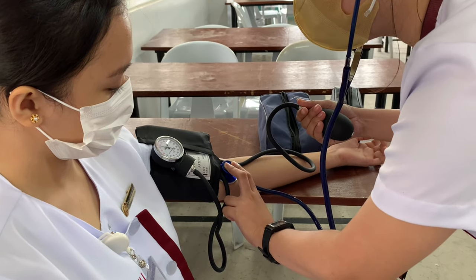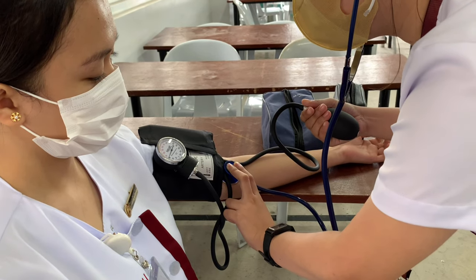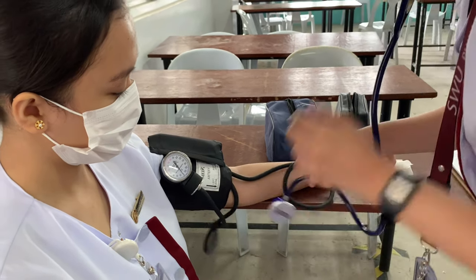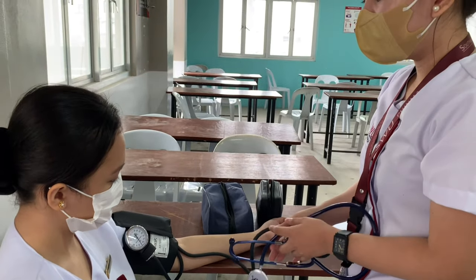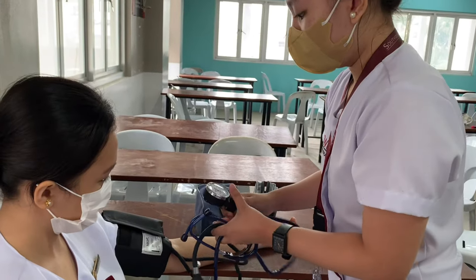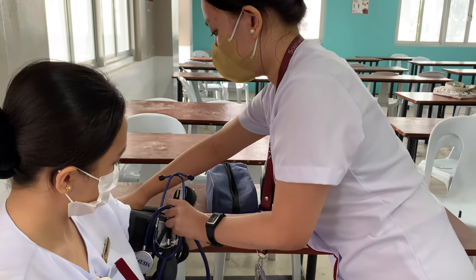Pump the pressure 30 mmHg above the point at which the pulse disappears, ensuring the cuff is inflated above the patient's systolic pressure. Note the point on the gauge at which there is an appearance of the first faint but clear sound, which slowly increases in intensity — note this number as the systolic pressure. Read the pressure to the closest even number. Release air entirely from the cuff and remove the cuff from the patient's arm. This prevents arterial occlusion and patient discomfort from numbness or tingling sensation.